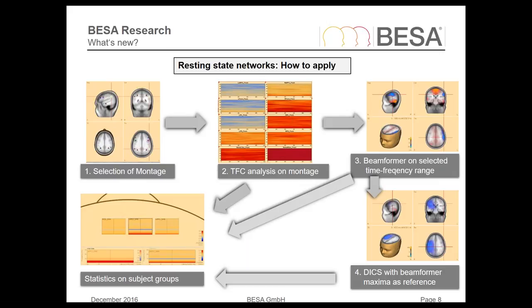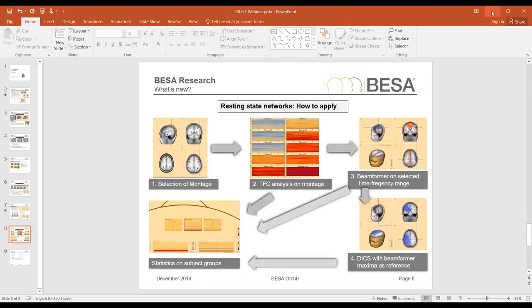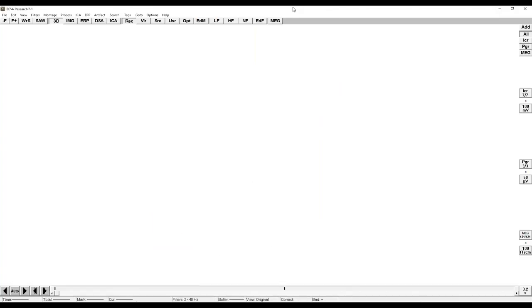Did I mention yet? We will have another webinar next week where we will focus on statistical analysis. This actually concludes our introduction. And now I'd like to show you how all this looks in practice. So let's have a look at the BESA Research application.